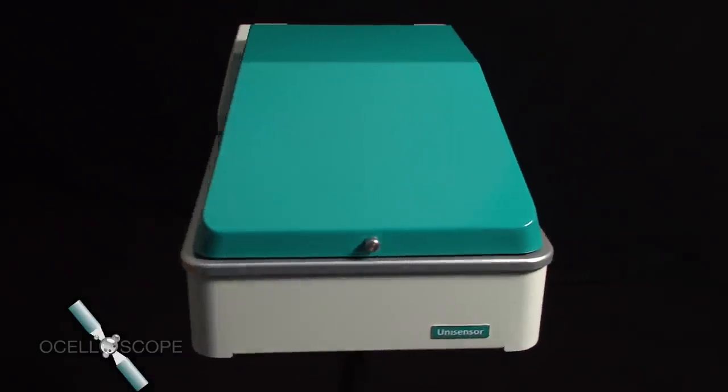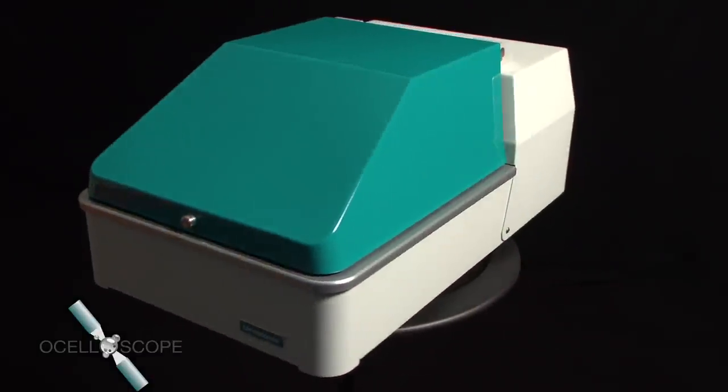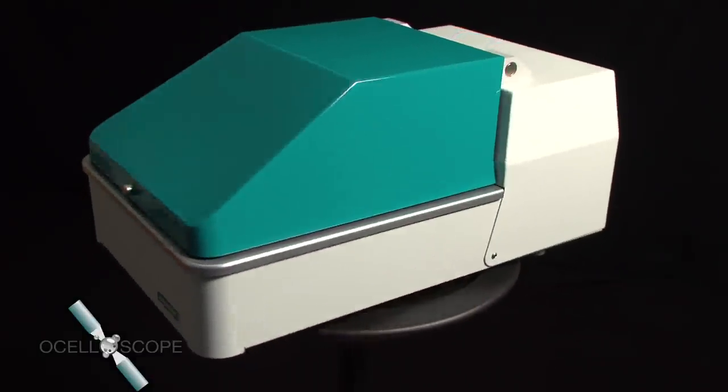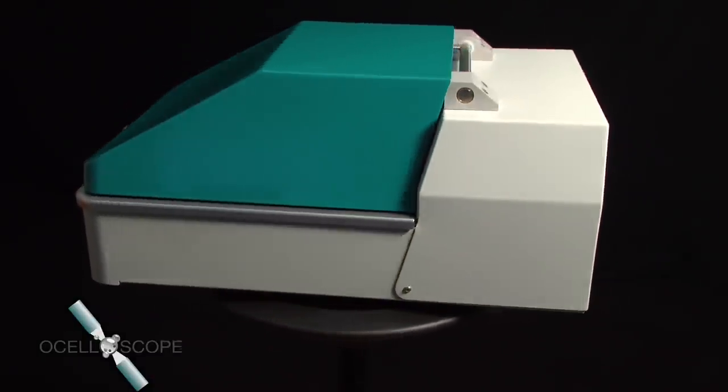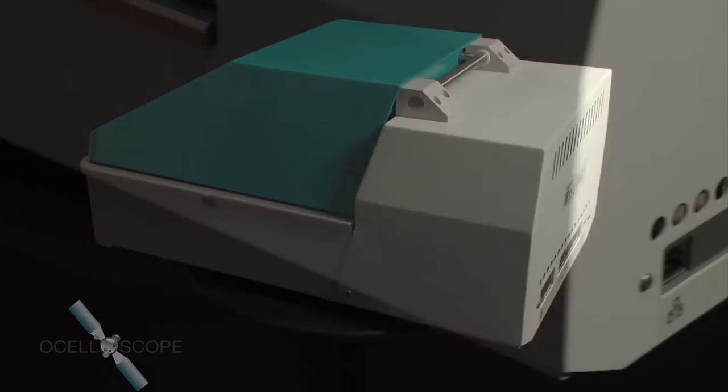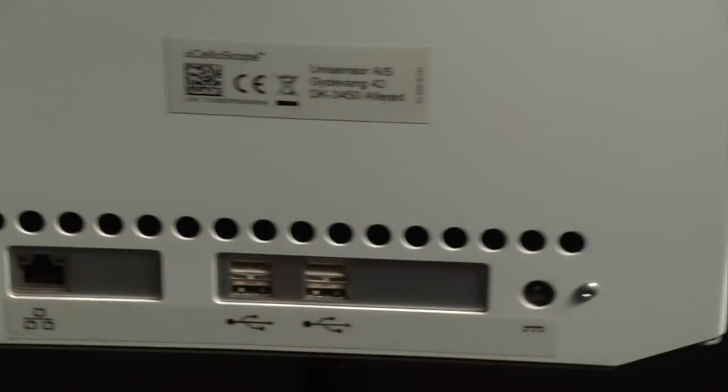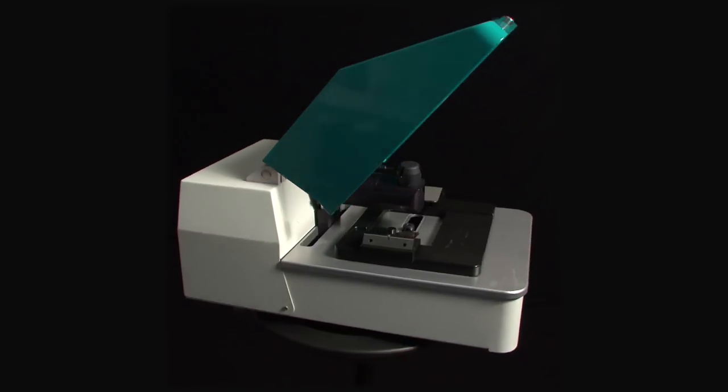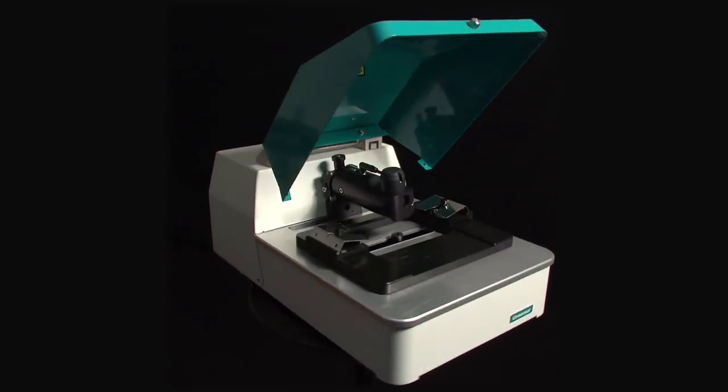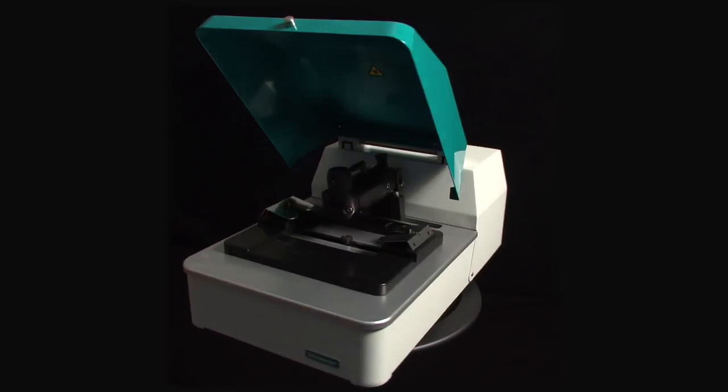Ocelloscope from Unisensor is the newest state-of-the-art instrument for measuring bacterial growth, among other things. The results can be read much faster than all other known methods, something that's vital in connection with determining antibiotic resistance.